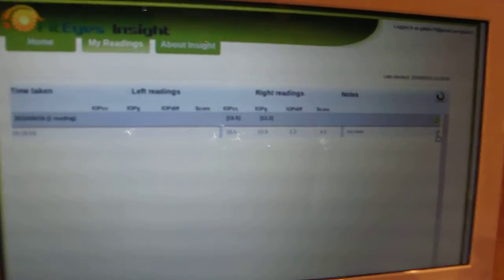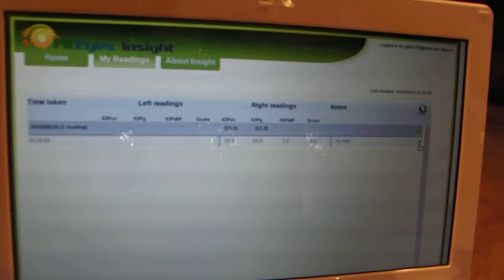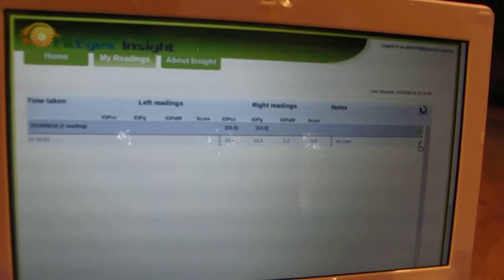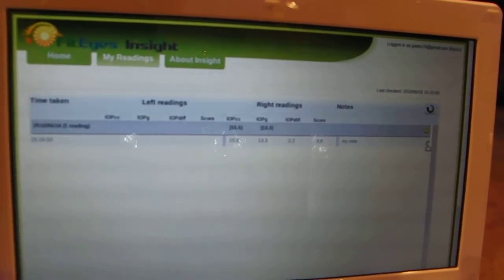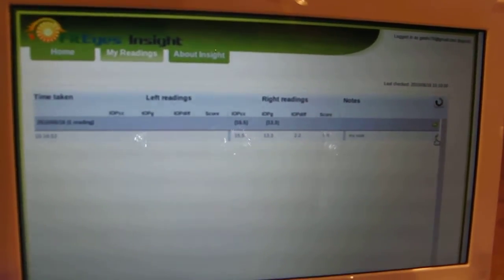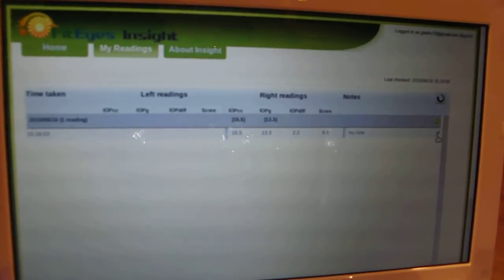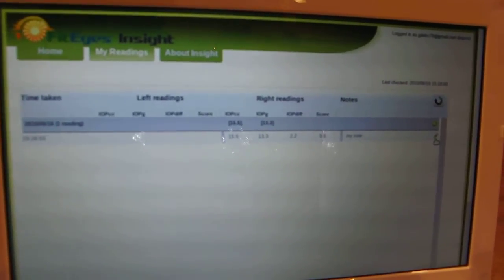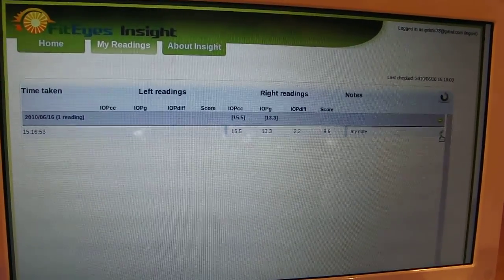So that's it. FitEyes Insight application and the tonometer. It's a very, very convenient, nice setup.